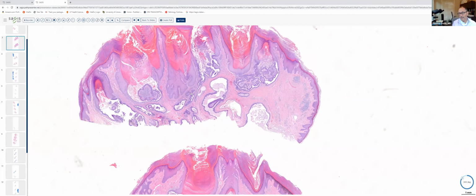And again, you'll see that attachment to the overlying epidermis. A hidradenoma papilliferum is also characterized by the papillary projections in cystic spaces. It has a maze-like configuration, tends to be located deeper in the dermis, and the stroma is non-inflammatory. And then finally, digital papillary adenocarcinomas are epithelial-lined papillary tumors located on the digits. So the biopsy will be from volar skin, and they tend to be characterized by a high degree of cellularity. So the glandular structures tend to be packed back to back. The degree of cytologic atypia can vary, however.